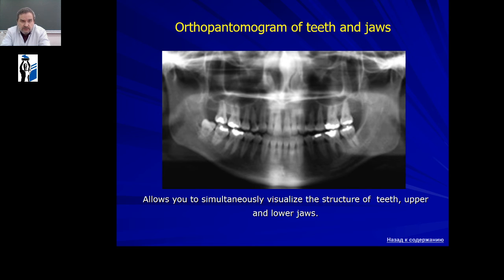Another picture. This is orthopantogram of teeth and jaws. Allows you to simultaneously visualize the structure of teeth, upper and lower jaws. This method is often used in stomatology.